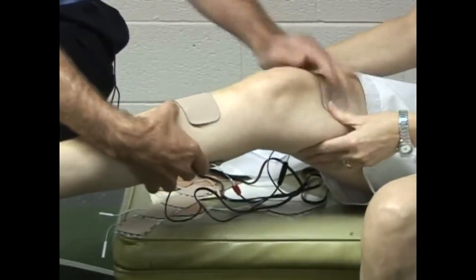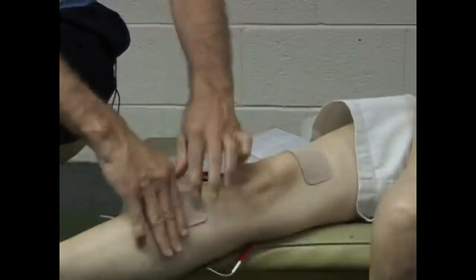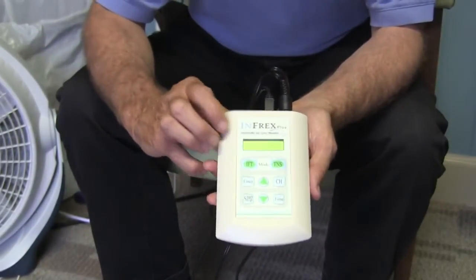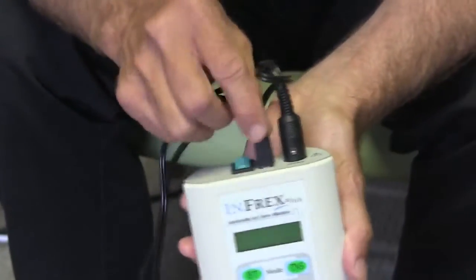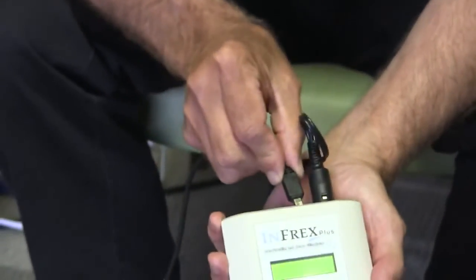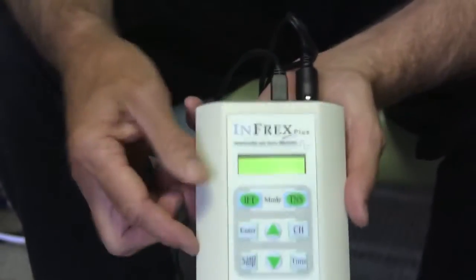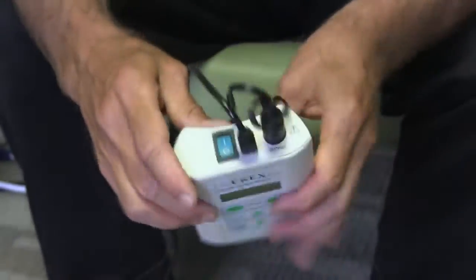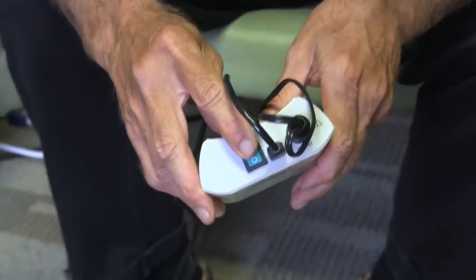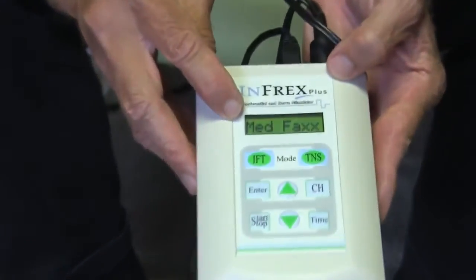Now you've got the unit, you've got your electrodes, and you have placed them in the area of pain. Let us show you how to actually operate the unit. On the top you see a toggle switch, and I've already plugged in an external AC adapter into the wall. Plug this in the top and make sure electricity is coming into the unit. You don't need batteries when using electricity. Go to the top and there is a toggle switch — simply push it and you will see MedFax come up on your screen.